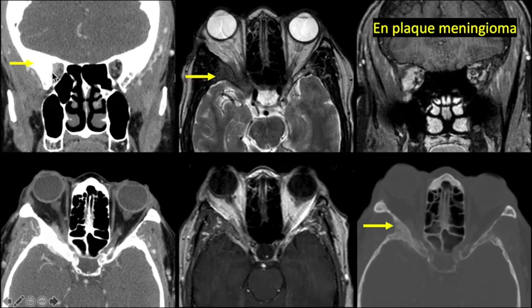Here we see expansion and sclerosis of the greater wing of sphenoid on the right side with soft tissue mass in the orbit near the apex. Whenever there is a mass near the apex, we should describe the location because it can cause compression and ischemia of the optic nerve. A mass lesion is seen in the intracranial portion, with abnormal enhancement and sclerosis of the greater wing of sphenoid. Prostate metastasis or sclerotic breast metastasis can also produce this appearance.